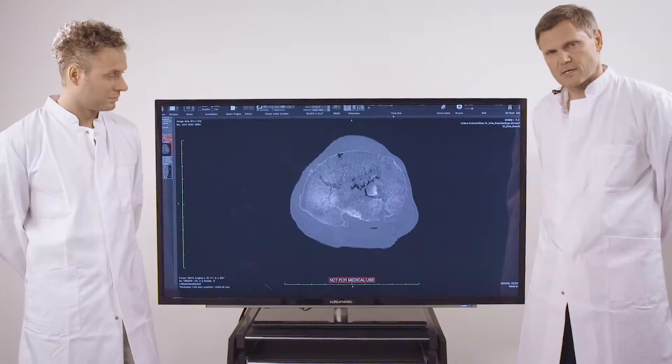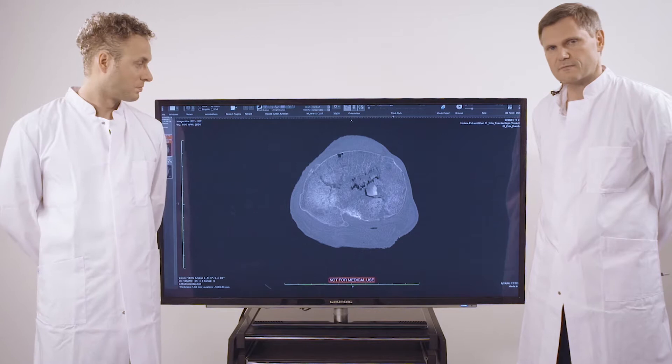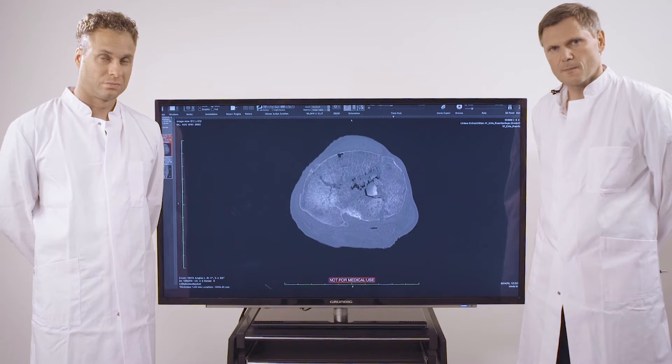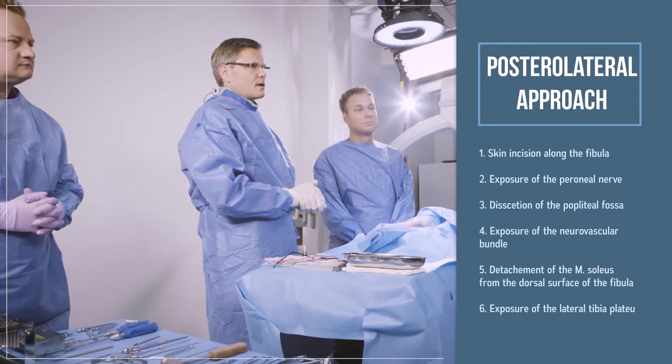As mentioned before, we are going to do this treatment on a cadaver knee with a lifelike fracture. In my opinion, it is a very realistic fracture situation, so we can take a close look at the approaches, demonstrate the anatomy precisely, and take all the time we need to exactly explain the procedure. We are going to start posterolaterally, demonstrate the fracture, reduce and fixate it, and then continue with the medial condyle to treat it appropriately.